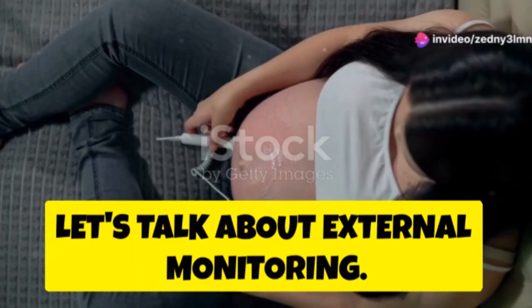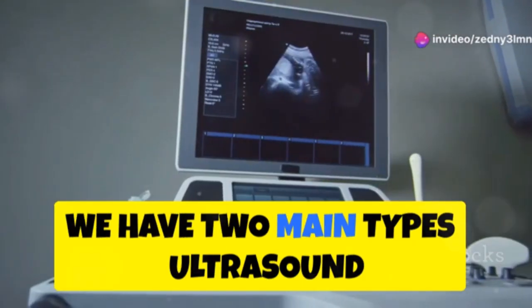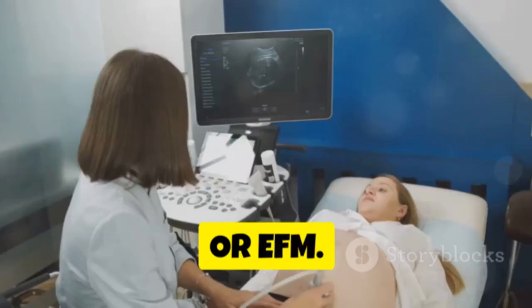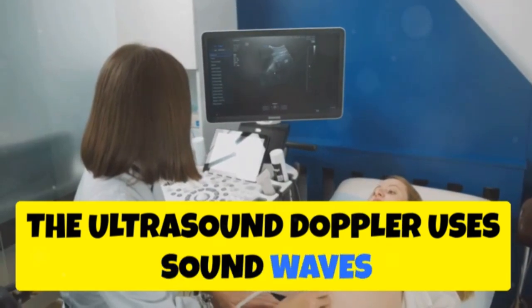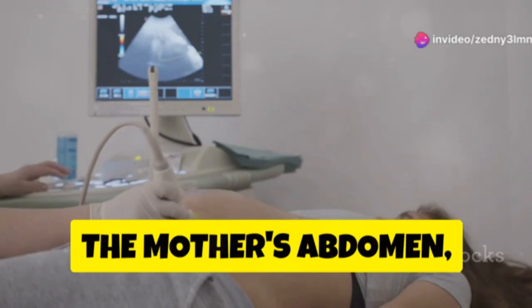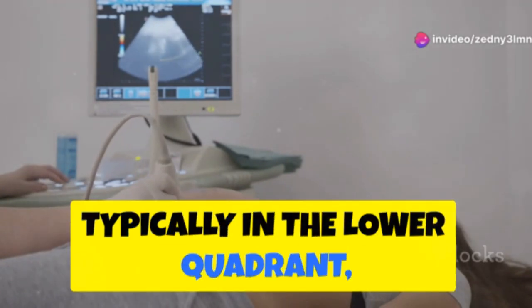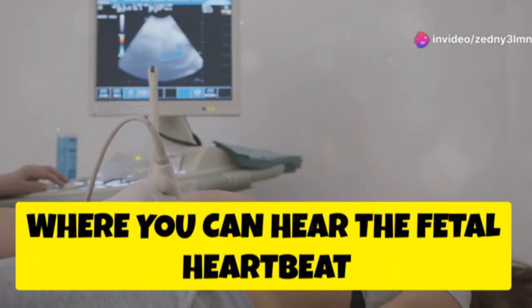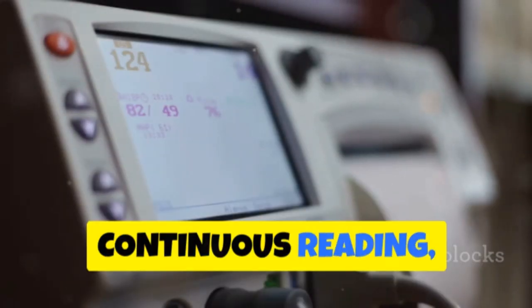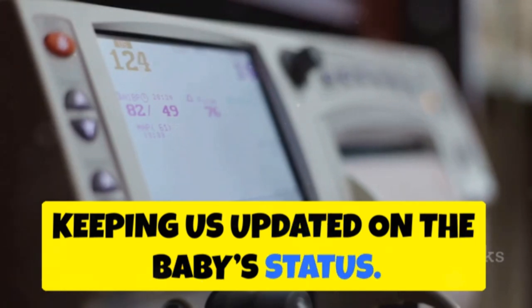First, let's talk about external monitoring. We have two main types: ultrasound Doppler and electronic fetal monitor, or EFM. The ultrasound Doppler uses sound waves to detect the fetal heart rate. Imagine placing the Doppler transducer on the mother's abdomen, typically in the lower quadrant, where you can hear the fetal heartbeat most clearly. This non-invasive method provides a continuous reading, keeping us updated on the baby's status.